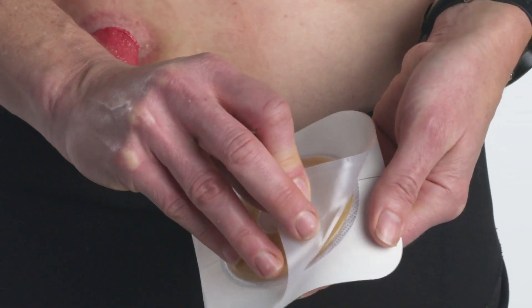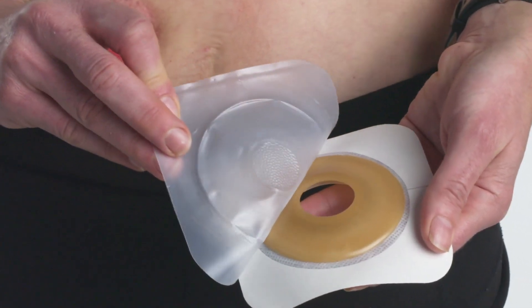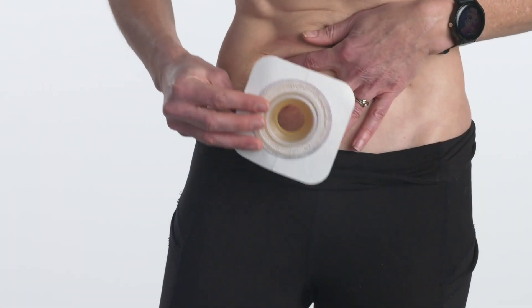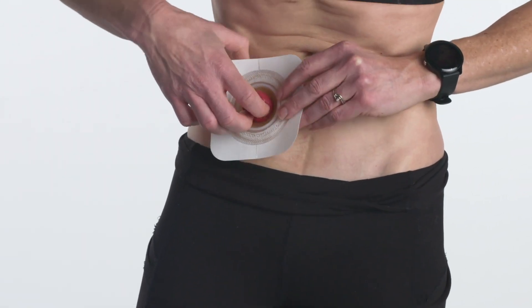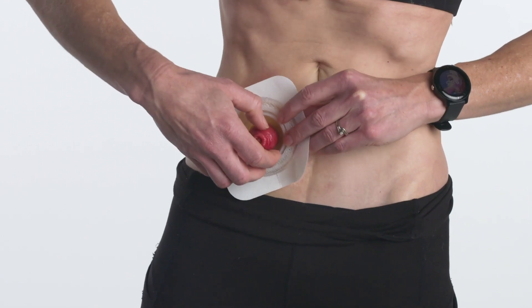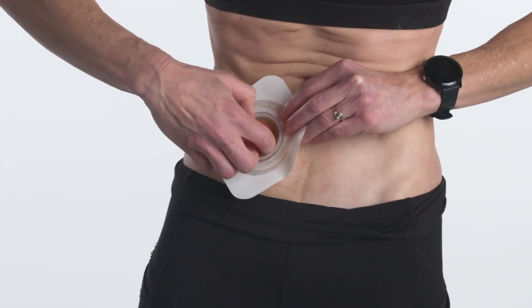Next, remove the clear release liner from the back of the skin barrier by pulling away the tab. Start the application by holding the barrier below your stoma. Starting from the bottom, carefully apply the barrier to the skin around your stoma.